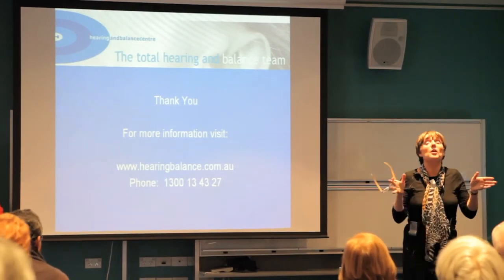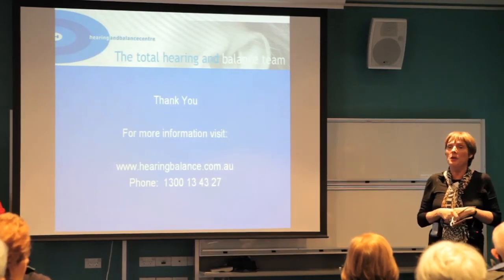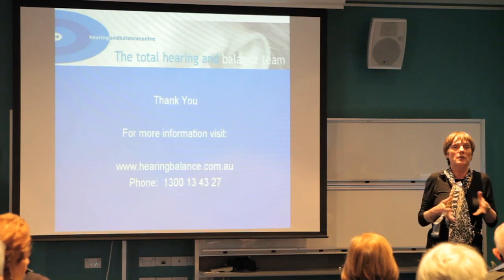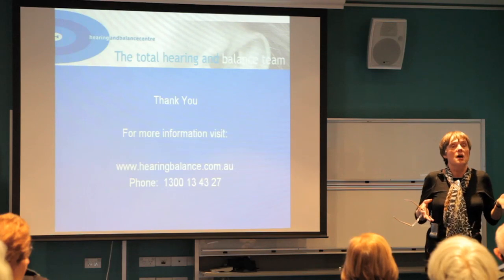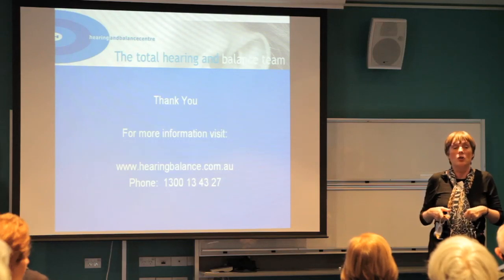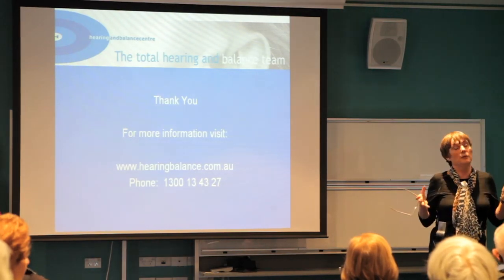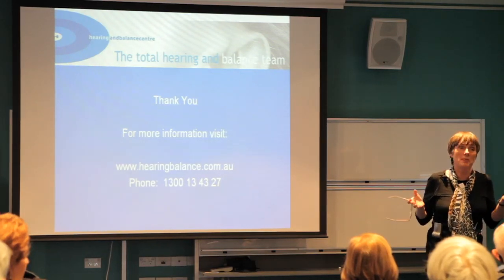One last thing I just wanted to say before ending, and that is that because a cochlear implant involves surgery, it's not the same as getting a hearing aid. It's always going to be different. There is always the risk of surgery, and of course there's always the fact that we cannot predict how a given individual will go. Although we have to work on averages, for one individual we can't say you're definitely going to score very well with a cochlear implant. We can't actually do that, and so this always has to be considered before anyone thinks about an implant.